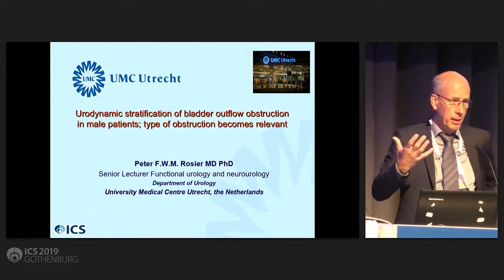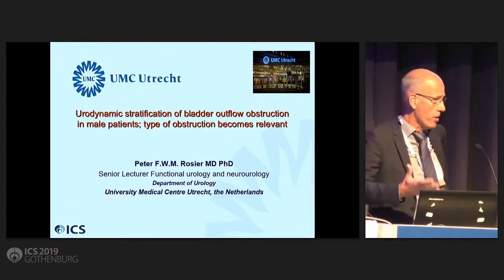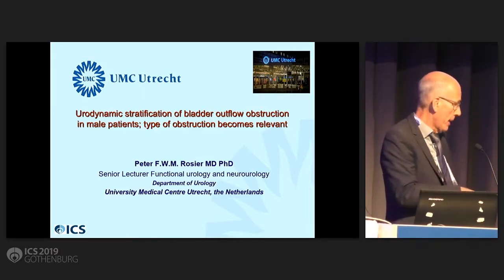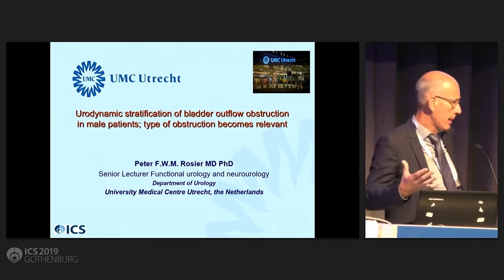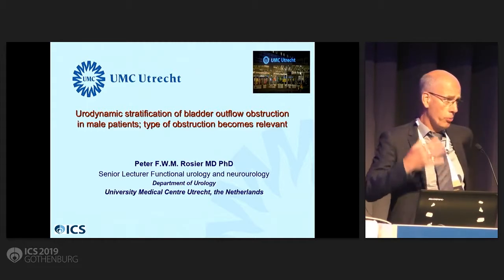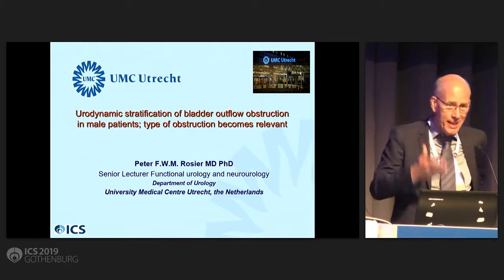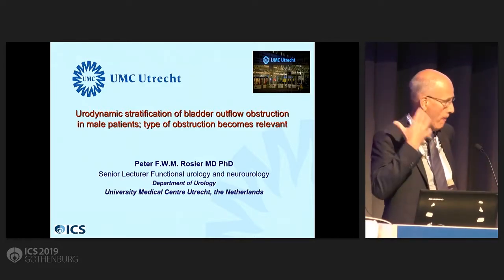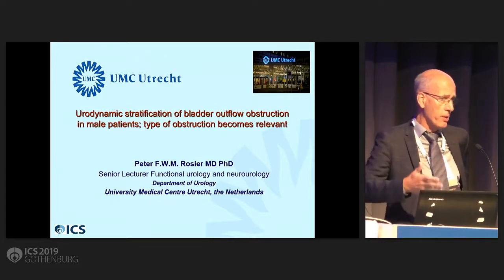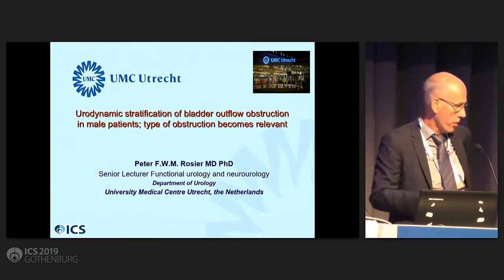And if you can show that the bladder neck or the prostate middle lobe is the problem, you would not do that. And if a prostate is very constrictive and small, you would not resect the mass, but you would incise the prostate. But again, that is only my speculation, and I can mention a number of studies that could give relevant answers, but we can discuss the rest of the day then.